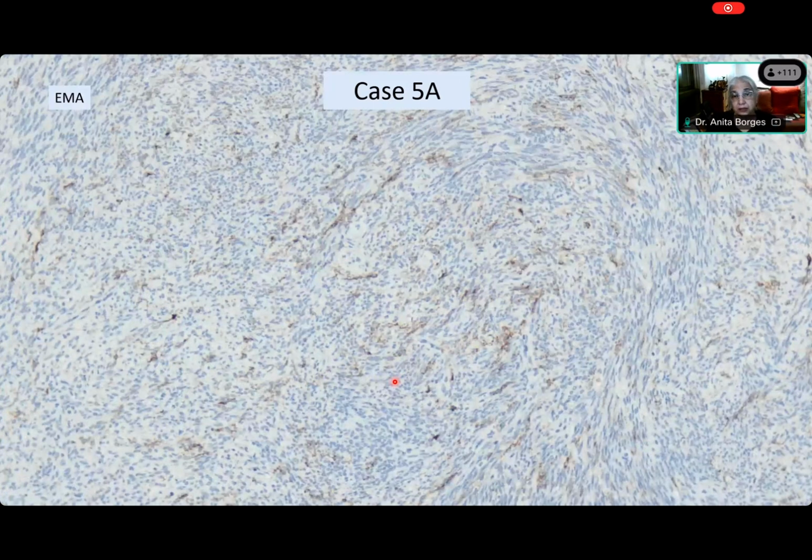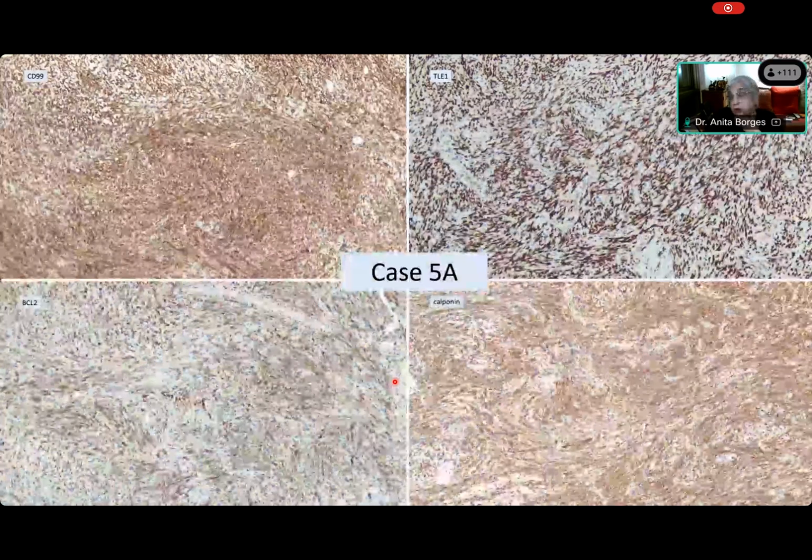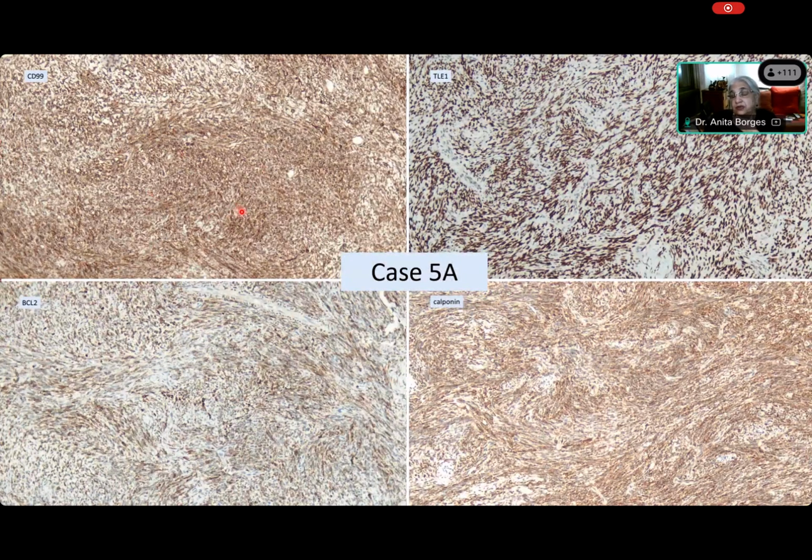Similarly for EMA, and sometimes the EMA is better than the cytokeratin. Okay, so you see some of the spindle cells with a very weak and focal EMA. Now we can see what I was telling about. CD99, that's MIC2, right? And it is very densely positive in this case.